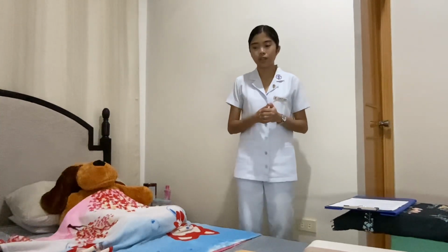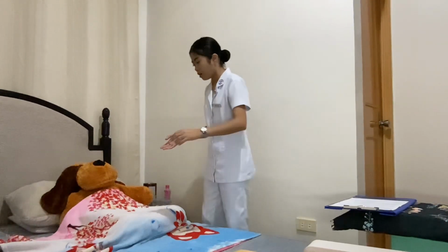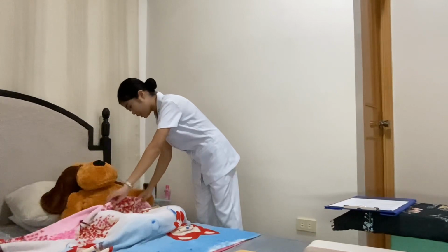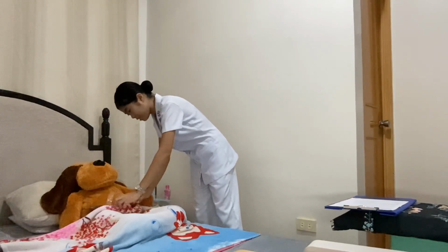Okay. Now that we have already gained the patient's approval for us to administer the medication to her, what we're going to do next is to provide the patient's privacy by closing the windows and closing the doors. Now, the next thing we're going to do is to bring down this blanket to expose the area, the injection site that we have selected.